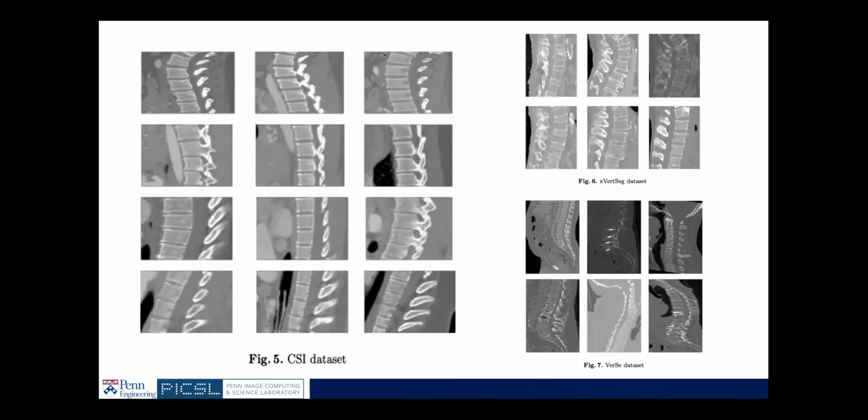That's our task. And the problem that we have is that at training time, let's say I have a lot of labeled examples for this particular data distribution, where these vertebrae images come from a healthy population, right? But at test time, all my data set is coming from a distribution which has only a diseased population.